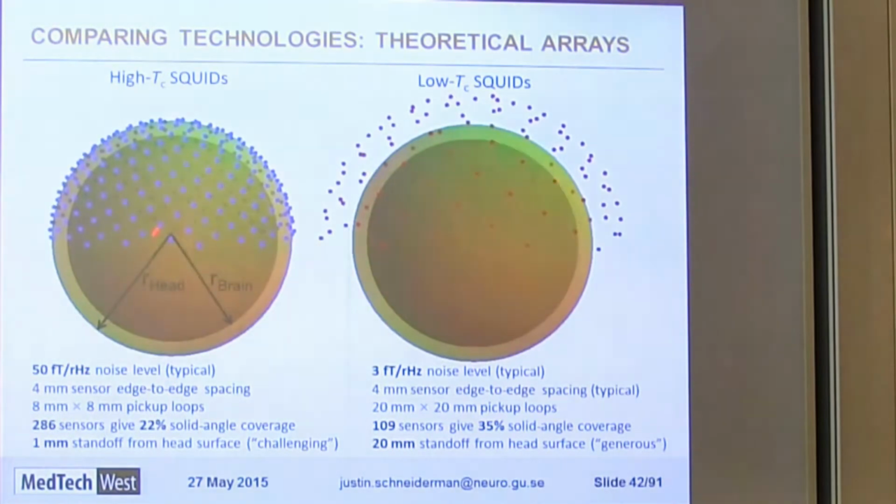Because of the lead field patterns overlapping between adjacent sensors, and in clusters of sensors around each other, each sensor is sensitive to currents to which many other sensors are also sensitive. You therefore have to orthogonalize the lead field patterns. You do a transformation of the lead fields such that each channel is then independent. That basically means you take a linear sum of several of these channels, and you know that the linear sum of this first orthogonalized channel is independent of the lead field pattern of another channel that you're adding to the system. Did that answer your question? More or less. Basically, what you need to do is separate the channels from one another. To do that, you take arbitrary linear sums of the channels, and you add and subtract them to make them independent of one another. Is that a transform? Yes, it's just a transformation. Okay.